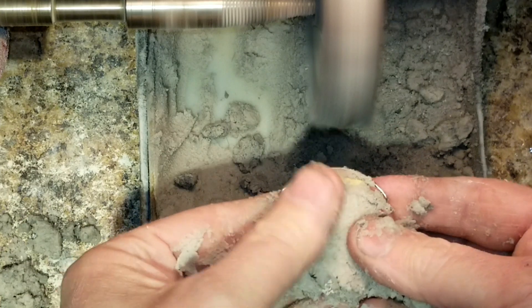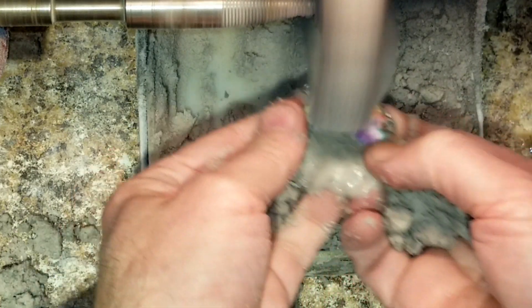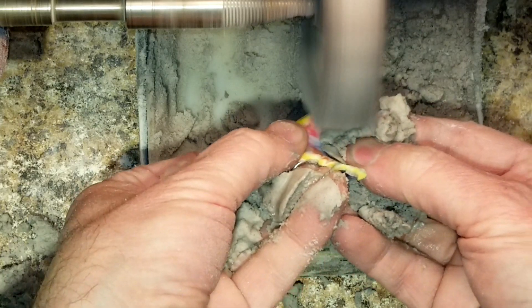Grab a handful. You want to keep that pumice feeding it.